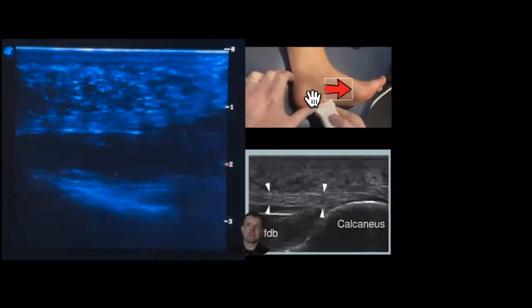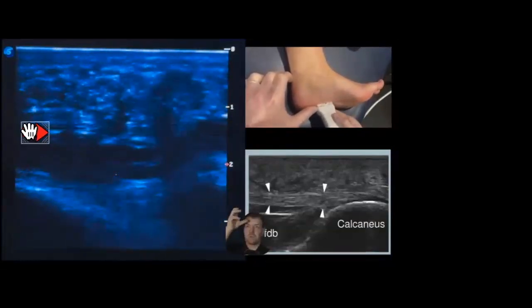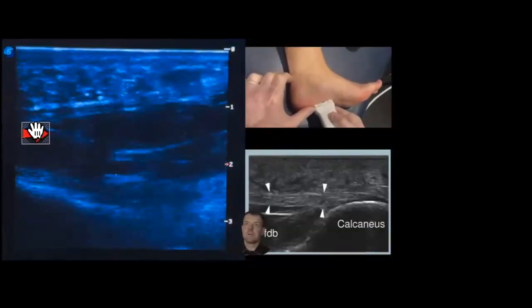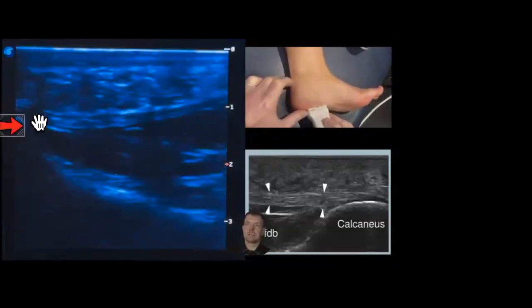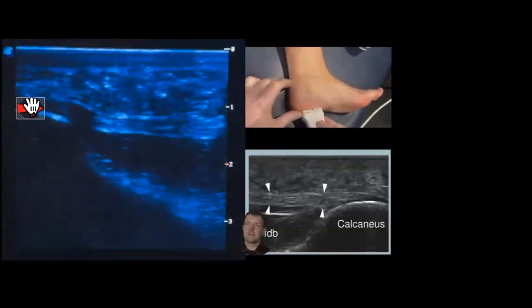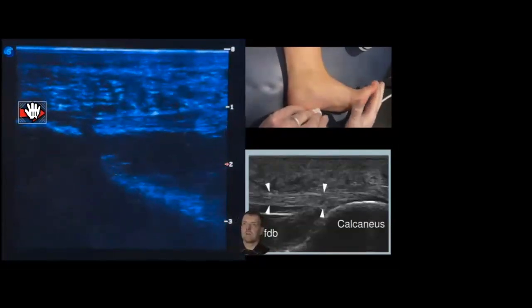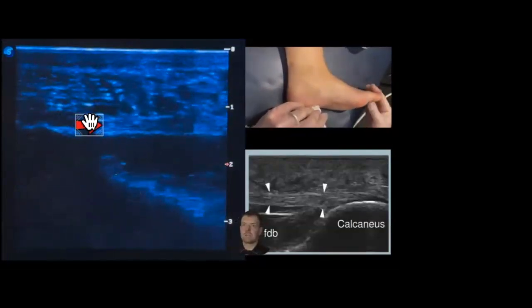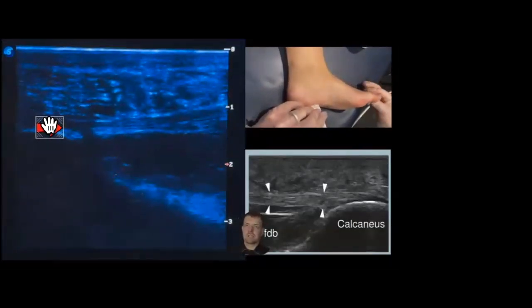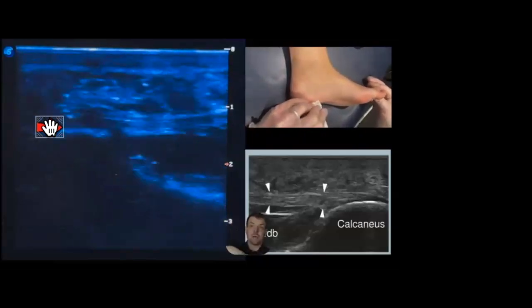And then I'll wiggle the toes in a minute so you can see the plantar fascia moving. There we go, there it is there. And then I go back to the calcaneus. And then here we go. So I'm just going to wiggle the toe so I can slacken and stretch. There we go. You can see it bending there. So I can slacken and stretch that plantar fascia just to check it dynamically as well.